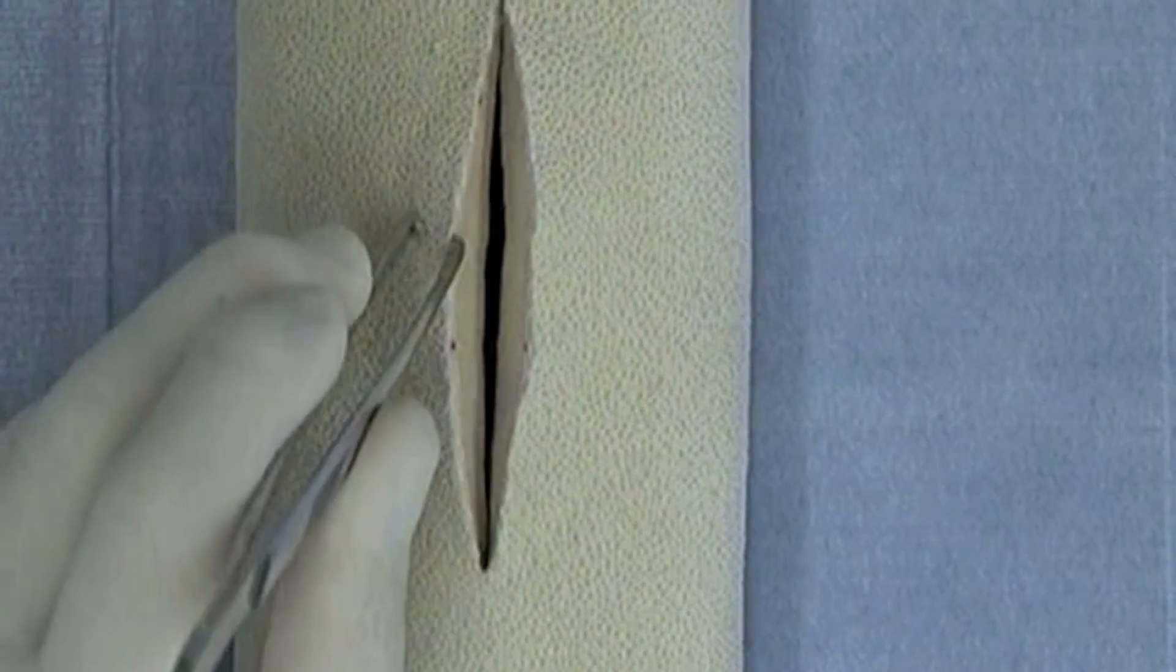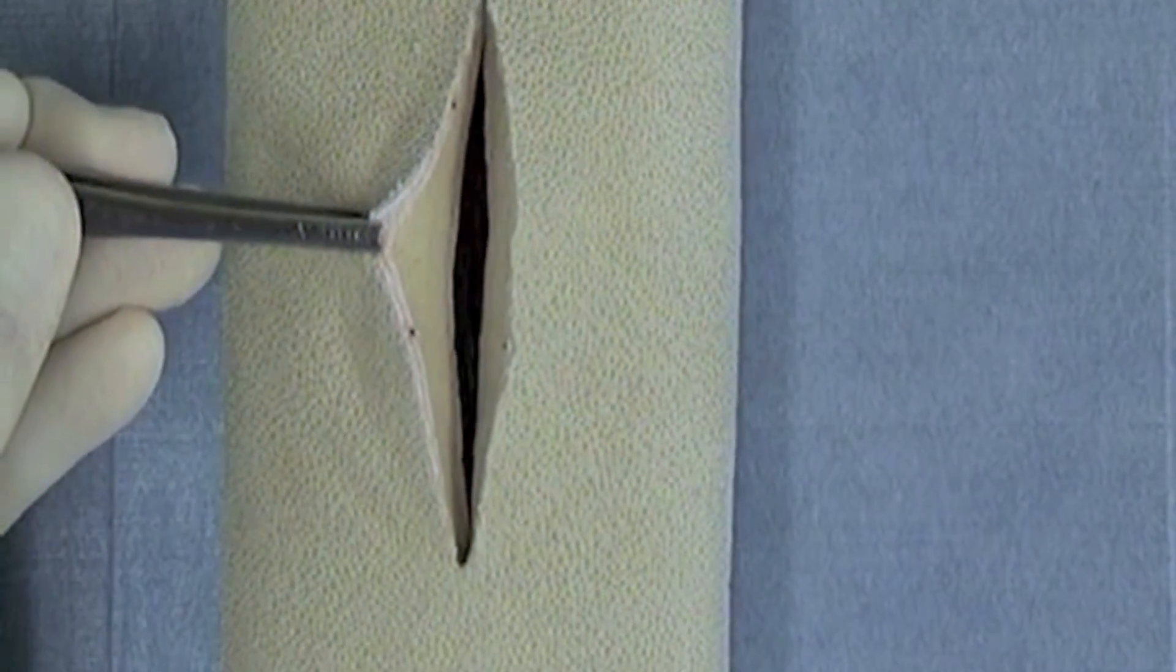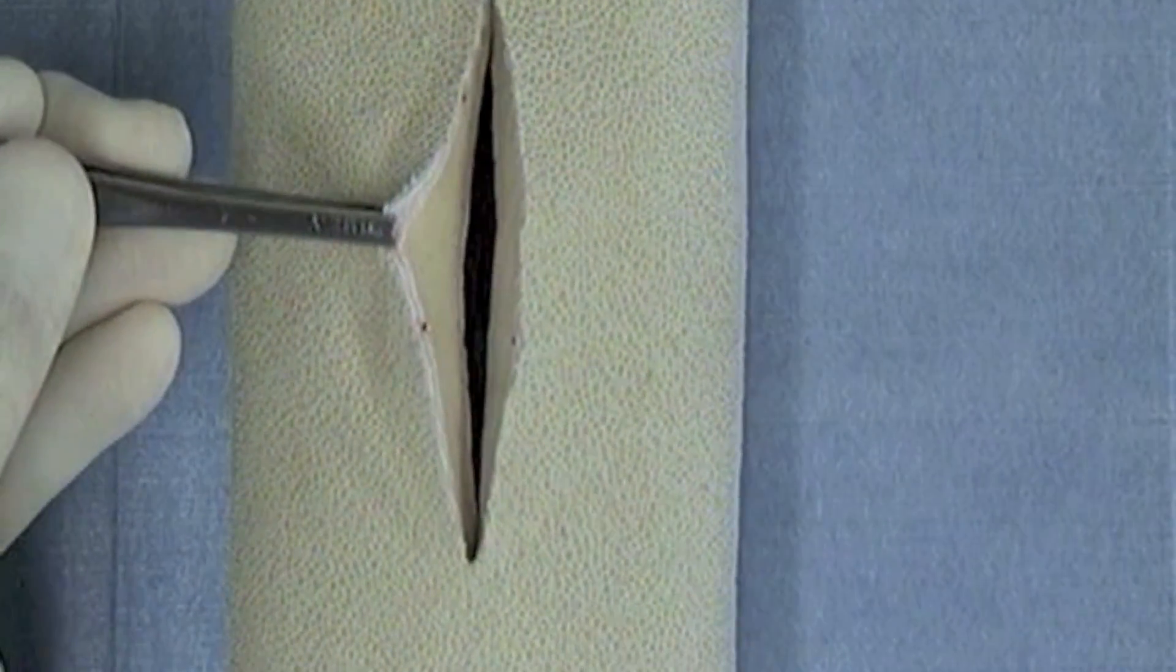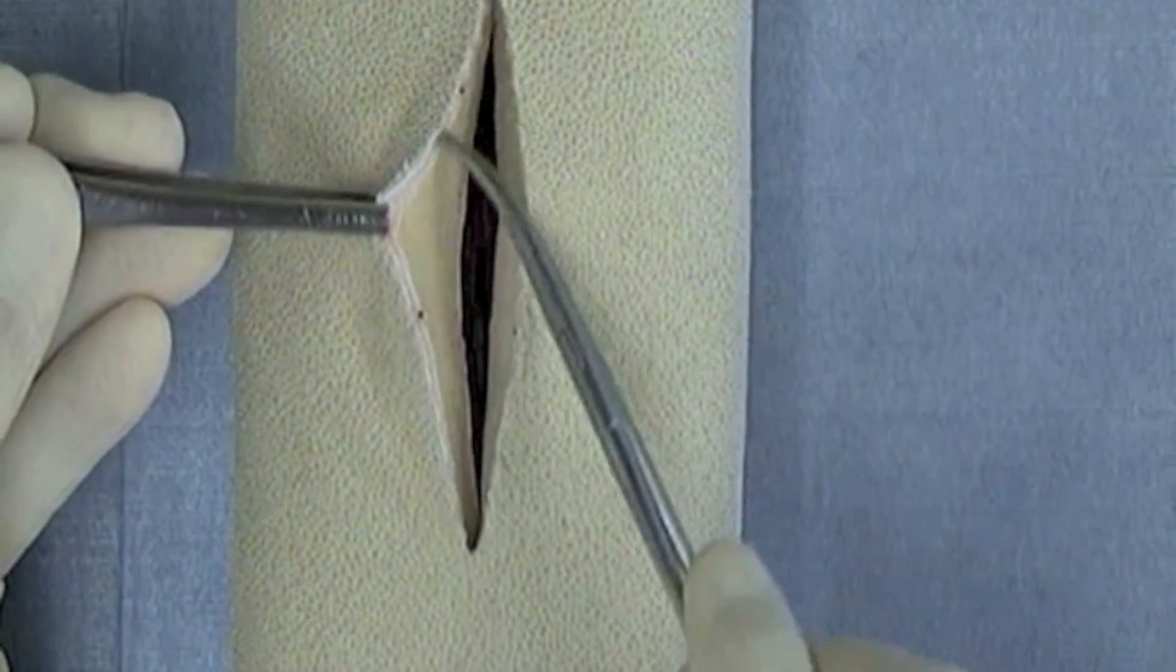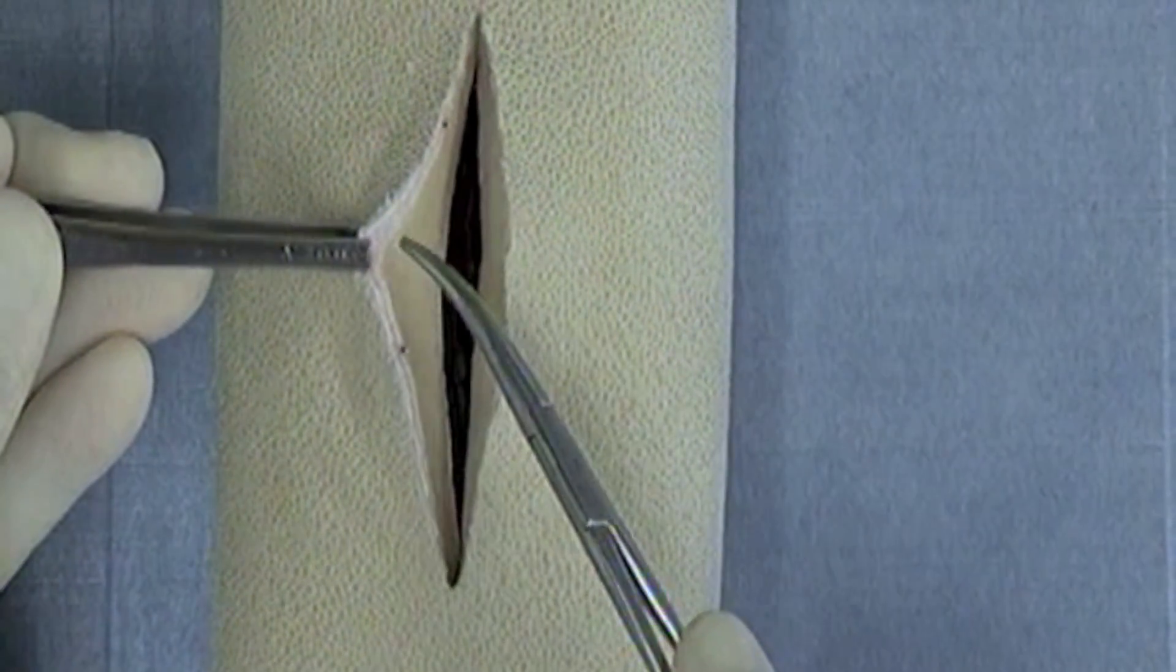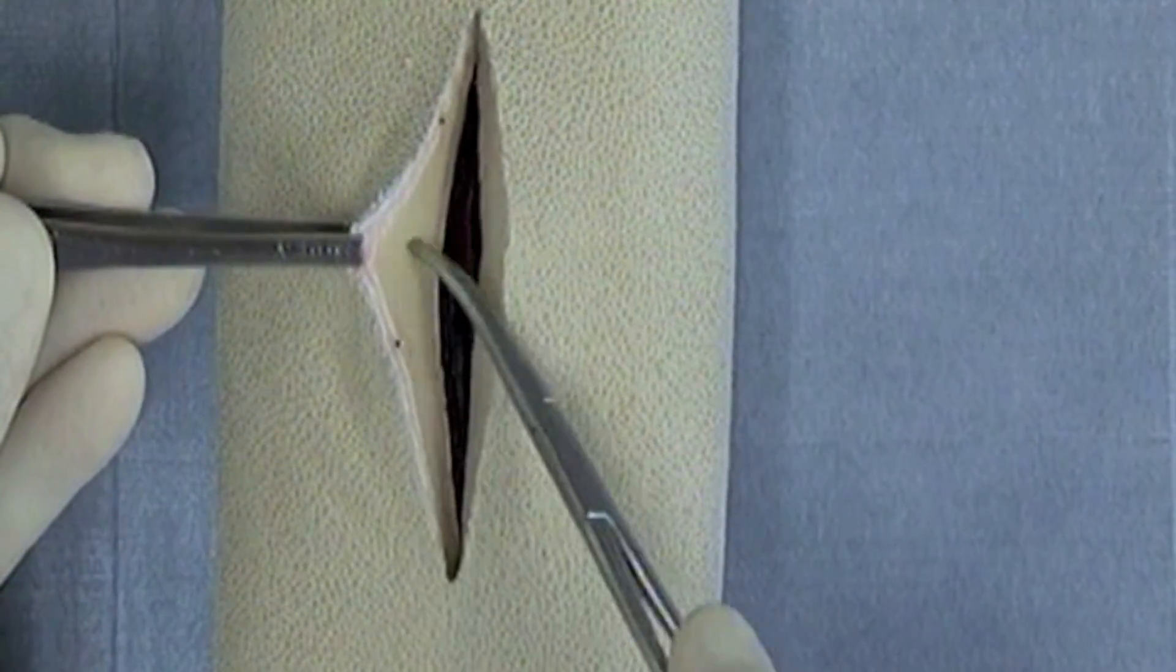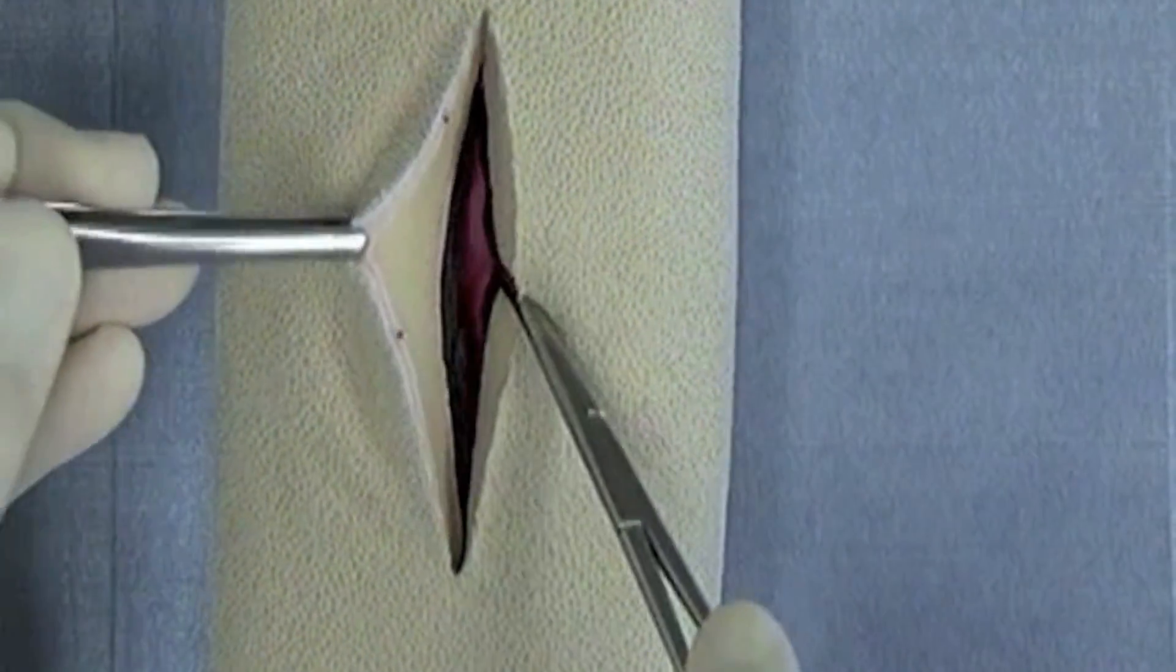I'm going to use a rat tooth forceps here to help identify a few of the layers. For instance, you will be using this white layer as the skin layer, and then this will be an expanded subcutaneous layer.